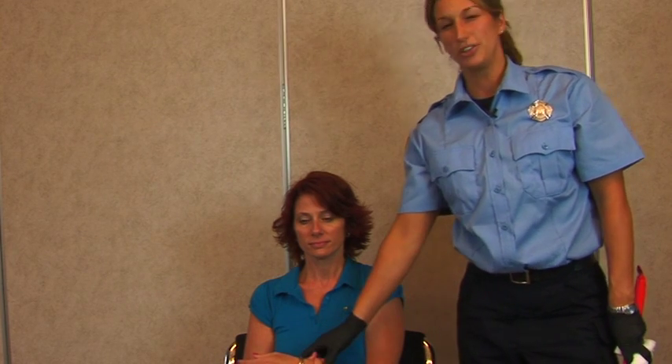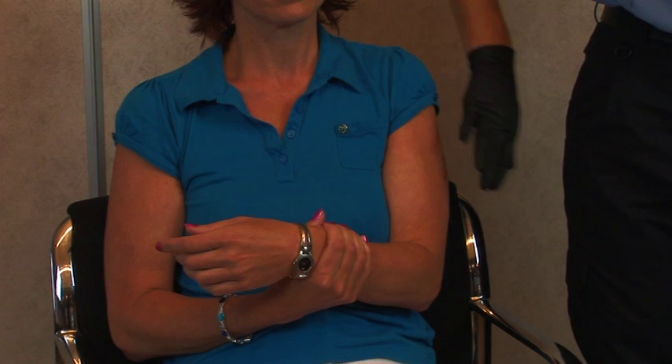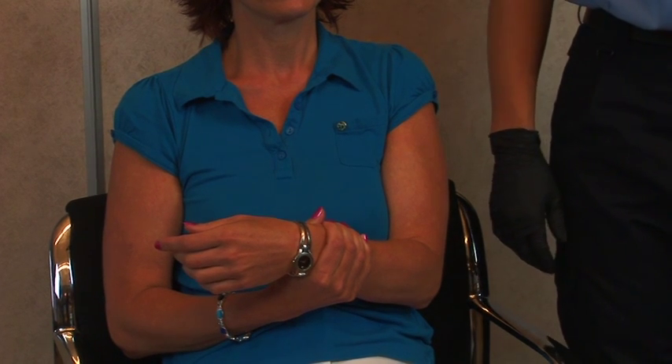When dealing with a fractured humerus, please refer to your local protocols. Normally when you come upon a patient that has a fractured humerus, they'll already have their arm in their position of comfort. You'll usually find them holding their arm. You just want to make sure that there's no break in the skin — that it's not a compound fracture and that it's just a simple fracture.